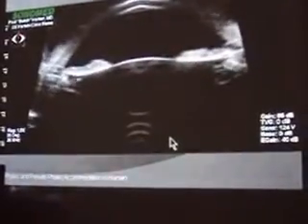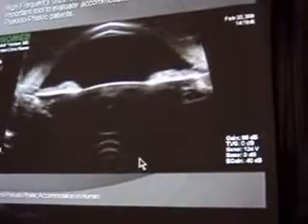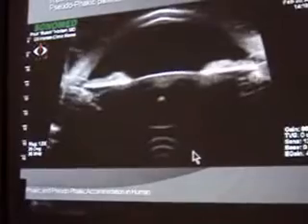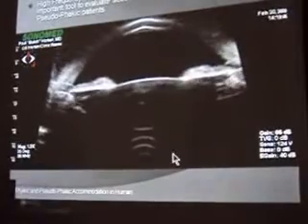The problem is that nobody was able to show them live, on a human eye, as we're showing now. If you see the picture on the clip, it's a very good example of what's taking place inside an eye when you are switching from far to near vision.